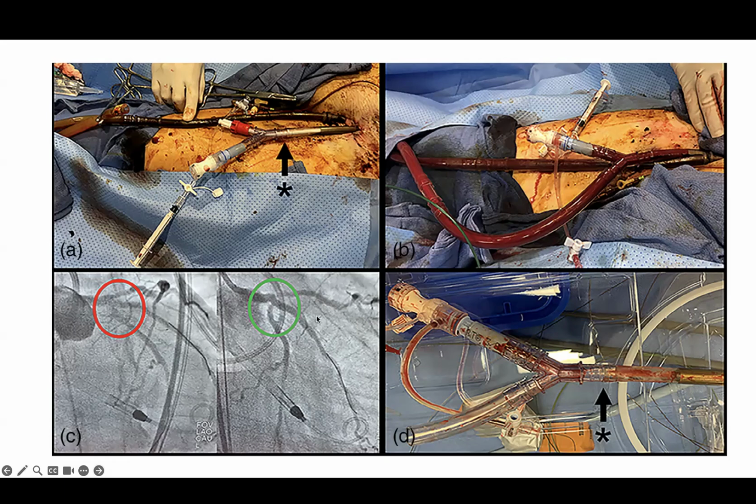But the neat thing was this. Longer catheters like the TIG and the Judkins are longer. I think they have guides too. I wonder, I don't know. 120. Yeah. But I guess the point that we're trying to make is that ECMO will continue to grow.